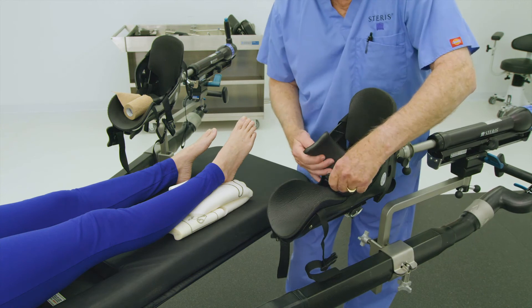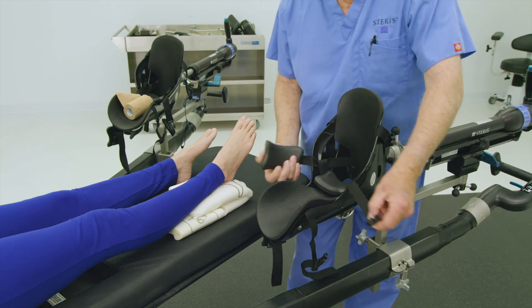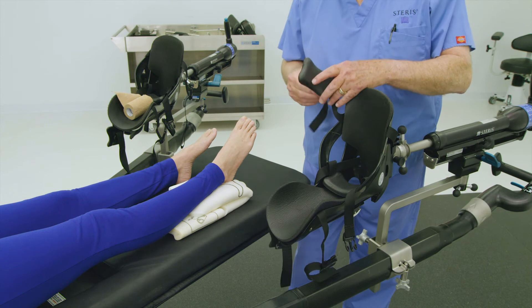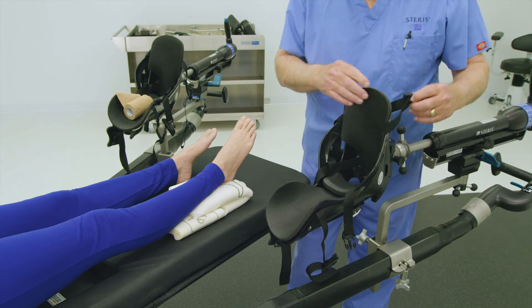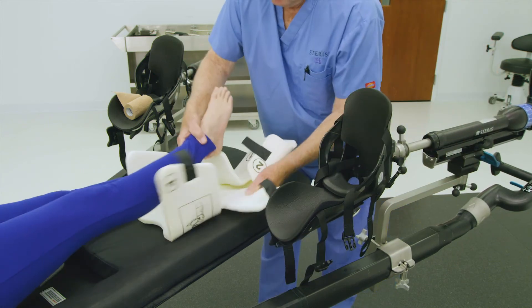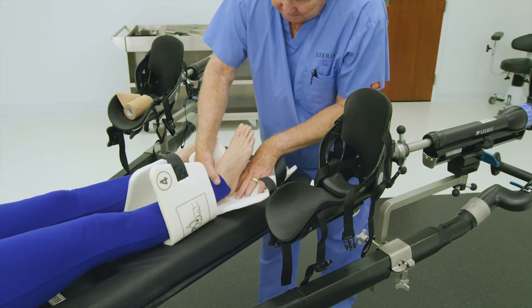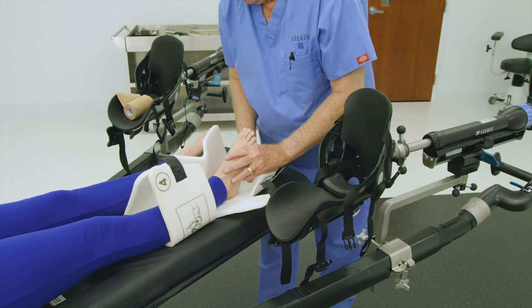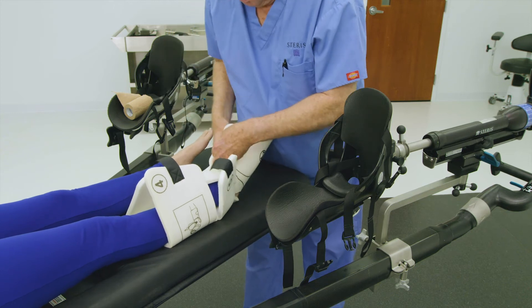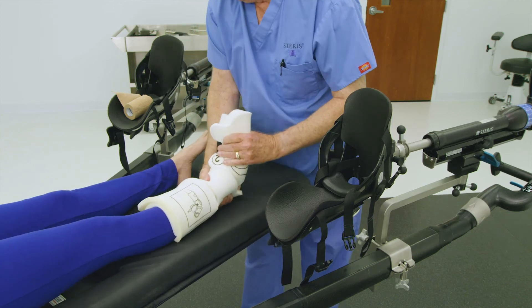Loosen the strap by pulling outward. If the buckles on the boot straps are not released, open the three buckles by squeezing tabs and lace straps over the exterior of the boot. Before placing the patient's foot in the traction boot, it must first be placed in a Steris traction boot disposable pad, or prepped using local OR materials such as gauze wrap and coban.